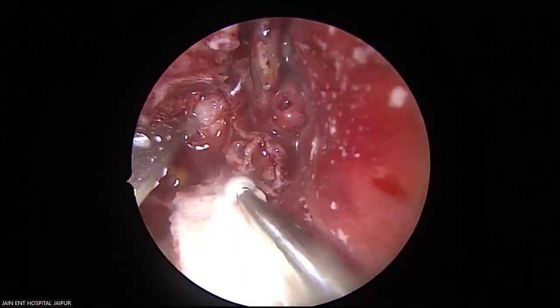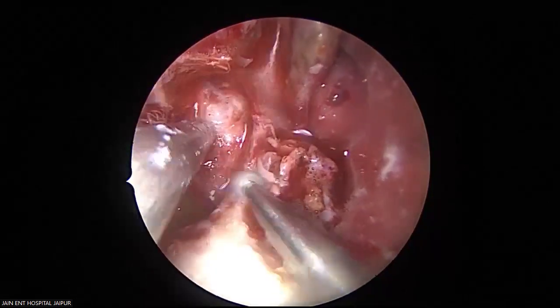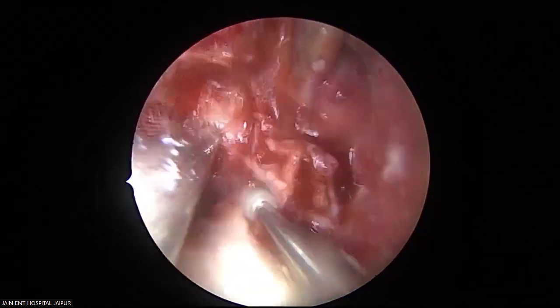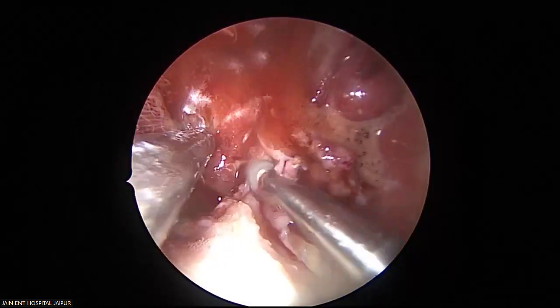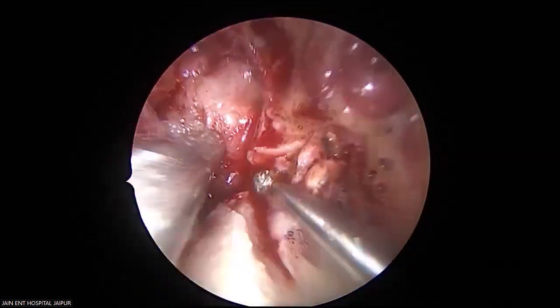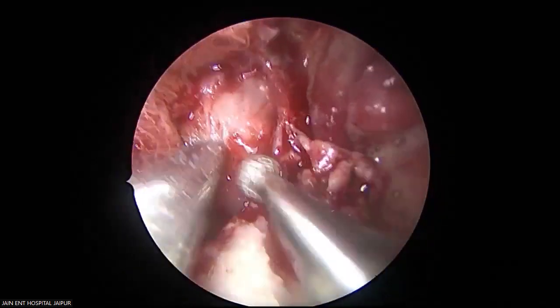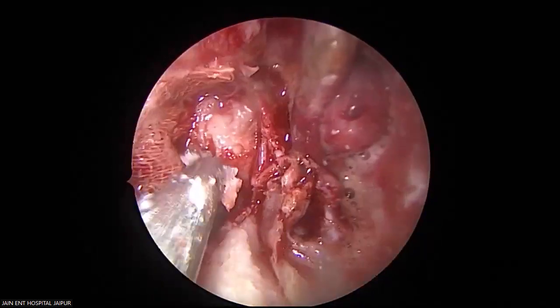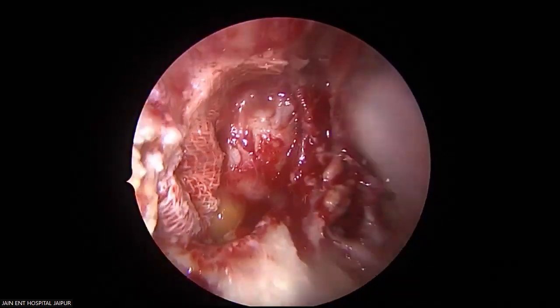At the same time being flushed with the posterior wall behind. See the posterior wall coming in pictures. Is the posterior wall thin? Yeah, this is the posterior wall. See, that's the posterior wall of the maxilla here, where you see the tumor bulge.